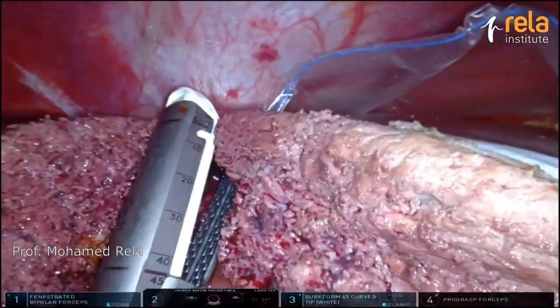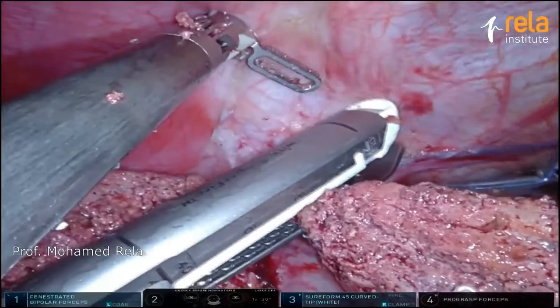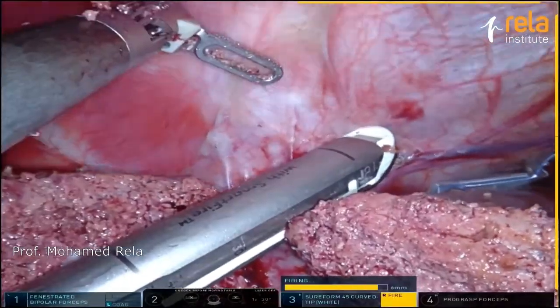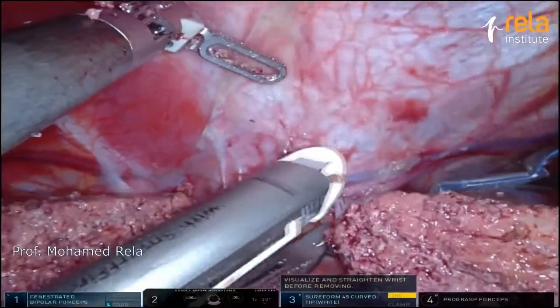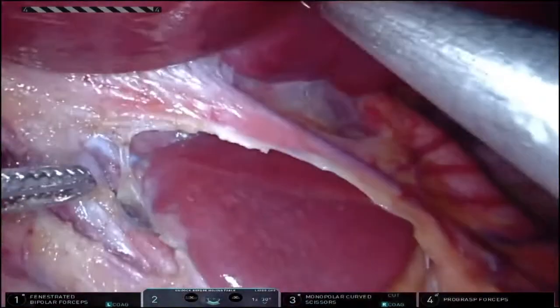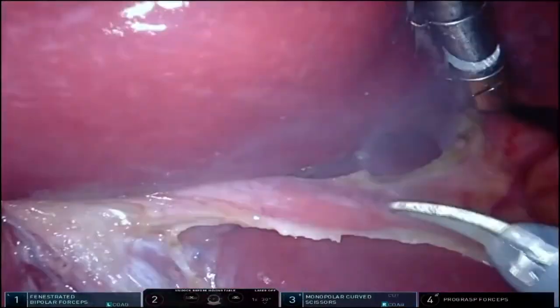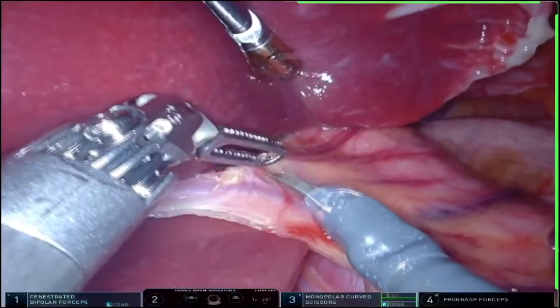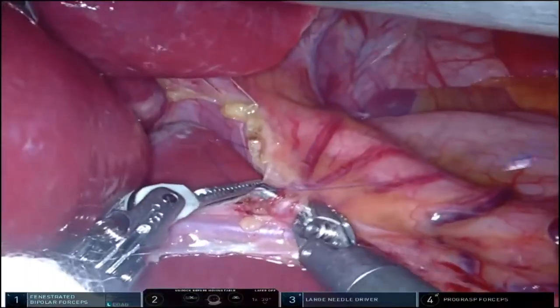This is a robotic stapler — a three-row stapler. That's another disadvantage of the robotic; you're losing maybe one or two millimeters of the length of the vein. I believe they are coming up with a two-row stapler. Most complex work can be done with the robot. I believe it can be even better than open surgery because of the visualization.